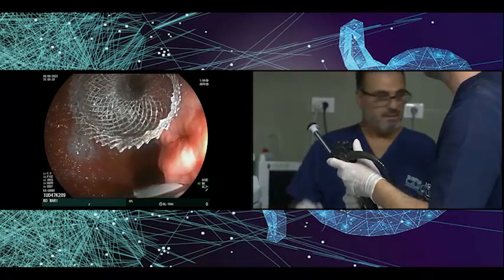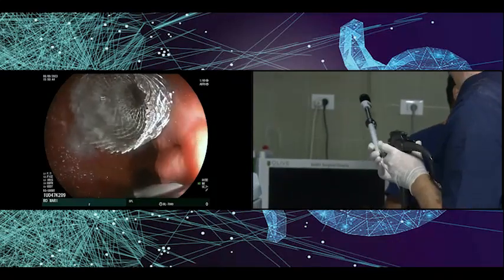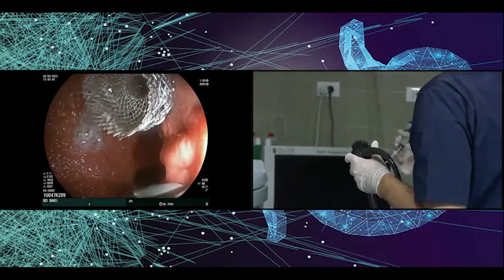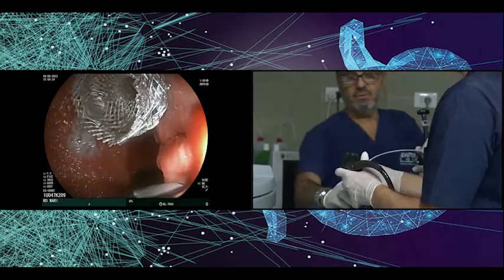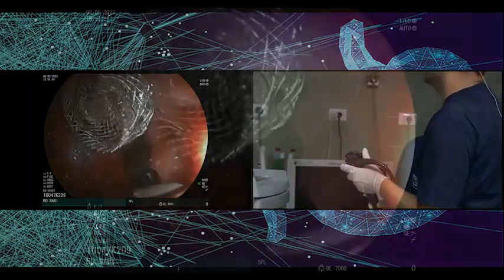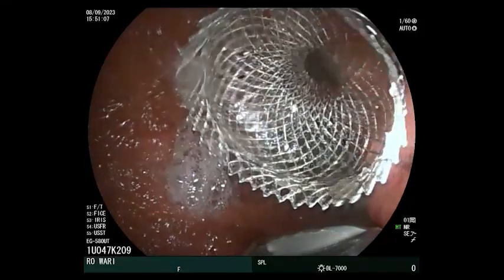which allows the collection. And after that, you retrieve the catheter, and now you can use a single channel catheter if you want to perform a sample for the bacteriological analysis and so on. So if you have a single catheter to perform a bacteriological analysis, it is possible. Just get a catheter.